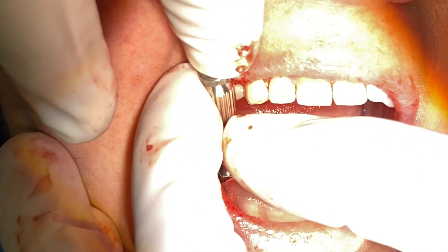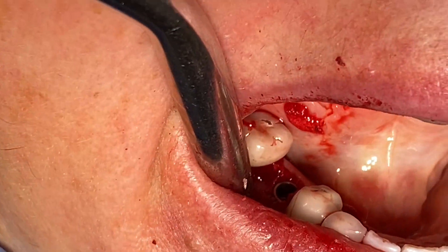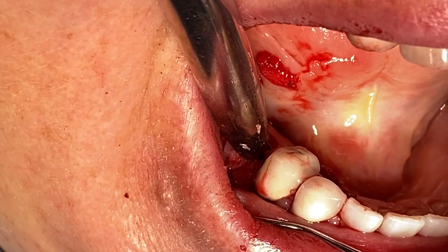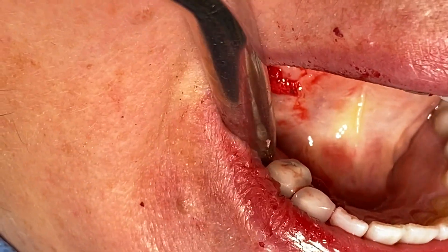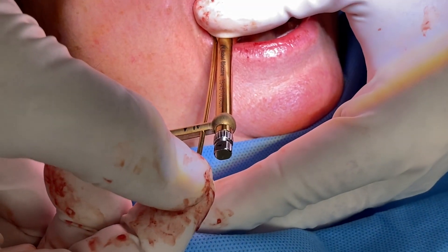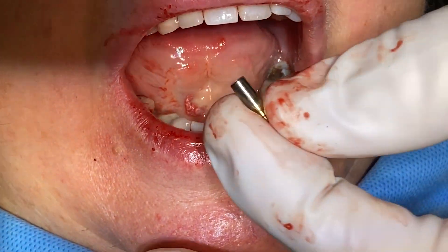The implant stops at the top of the ring, which tells me I'm at the correct angulation and depth for the implant to be restored. We want proper emergence profile and position of the implant so we don't get a food trap around this implant. The implant is exactly where we want it to be on our plan — just a little tiny bit below the bone, which is looking good. We can torque test this now with the template out of the mouth. This torque wrench goes up to 70 Newtons. When we torque test this, we're getting about 40 Newton centimeters, which is right on par for where this implant should be — nice and tight, but not too tight, because we don't want any bone necrosis.